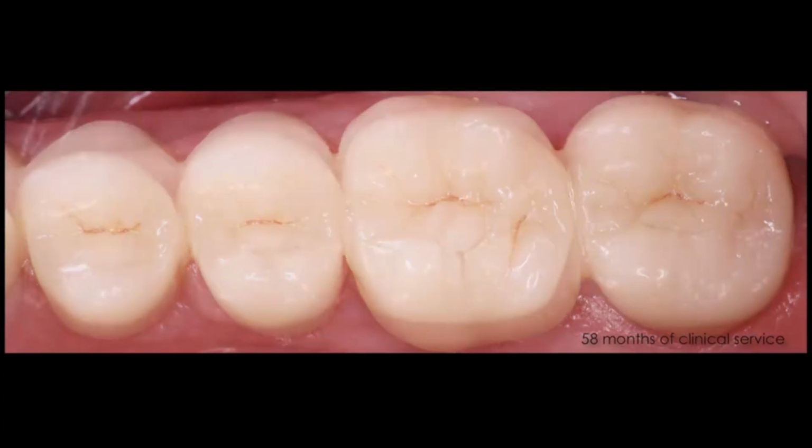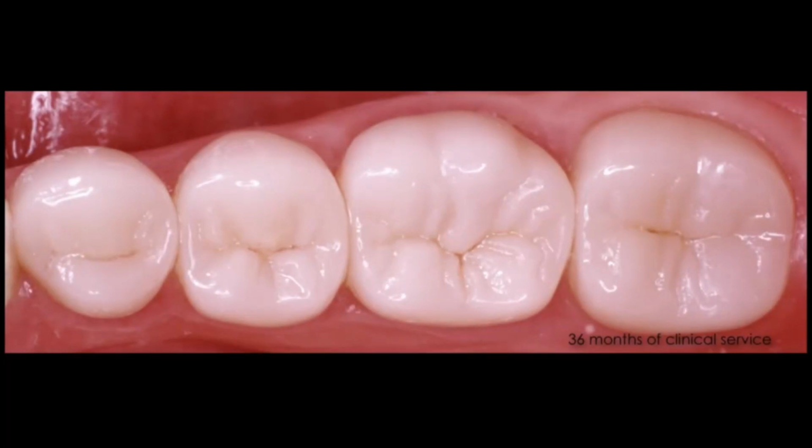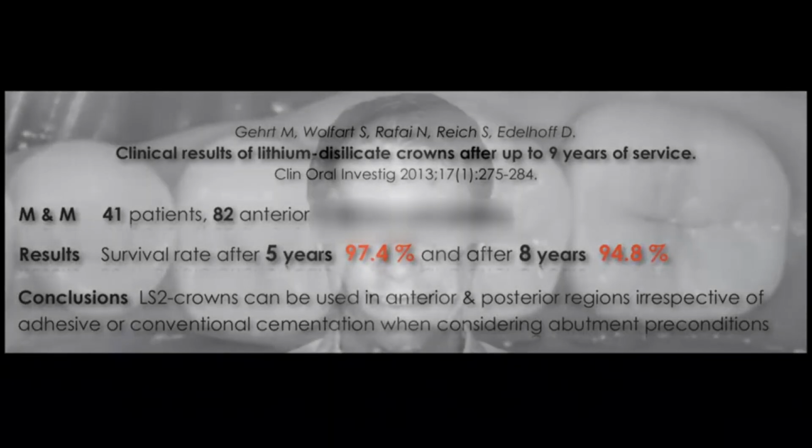And these pictures should really convince you to change your mind that you need monolithic zirconia. It's working with lithium disilicate ceramic if you use it in this described version that you have seen over here today. And you see again from the lower jaw, no changes, not so much changes in the morphology, not so much changes in the color, perhaps a little lack of glaze after almost 5 years of clinical service. So according to crowns, I can really convince you that it works out, even if you are using crowns with stratification, with veneering on the top, which are based on lithium disilicate ceramic. You have a survival rate after 8 years of almost 95% according to our studies. This is still a group of patients that I restored at Aachen University.